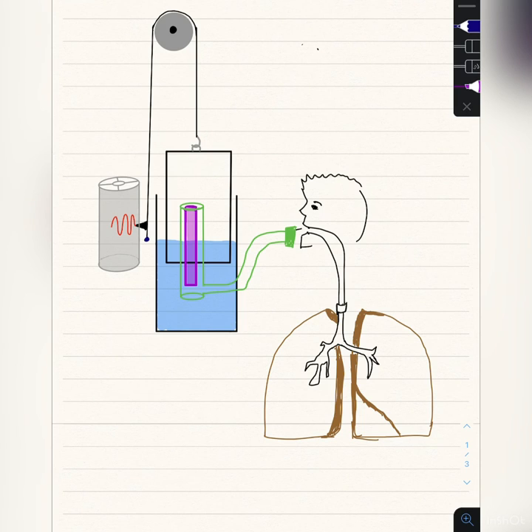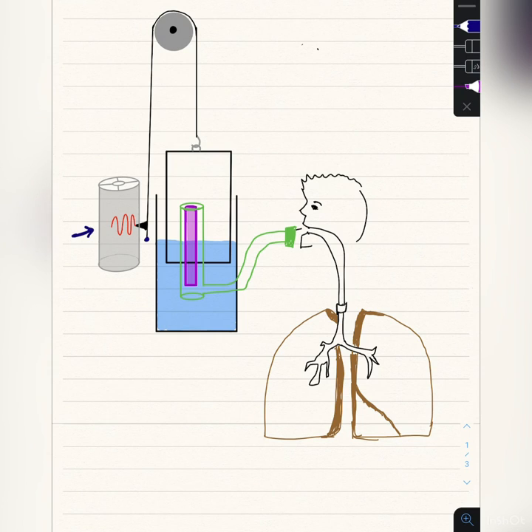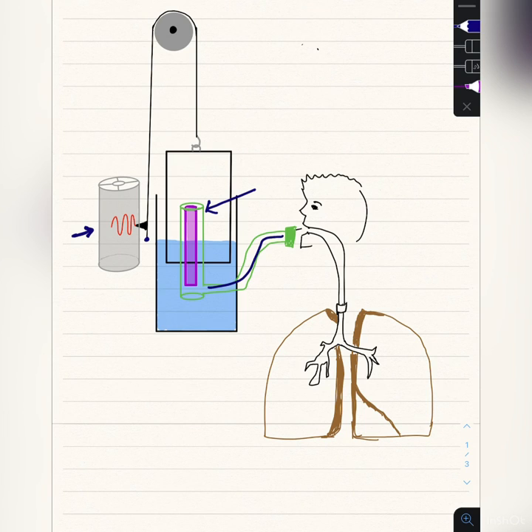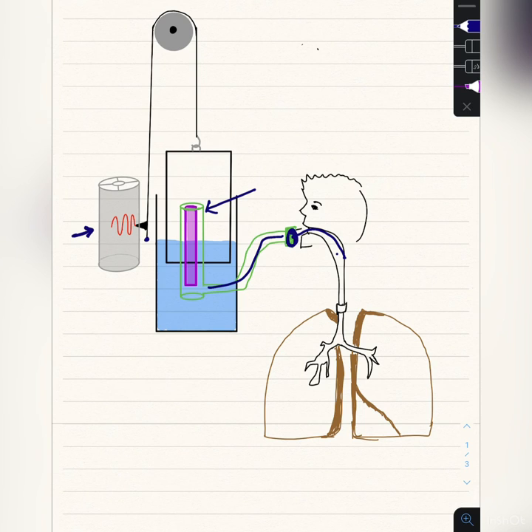On top of the water chamber a floating drum is placed inverted. The floating drum is connected to a string with a pulley and is counterbalanced with a weight. On the side of the weight a pen is attached, which measures different graphs on calibrated paper. The inner chamber — shown in green — contains a small metal tube connected from top to bottom, ending with a rubber piece and a mouthpiece from where a person inspires or expires.